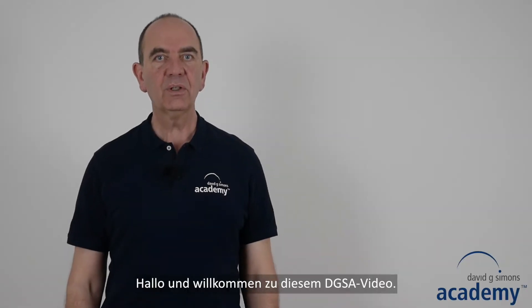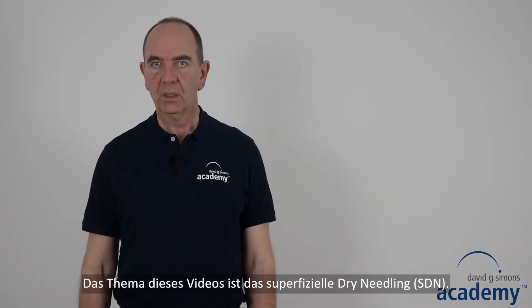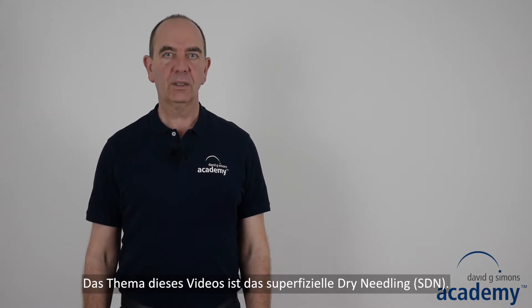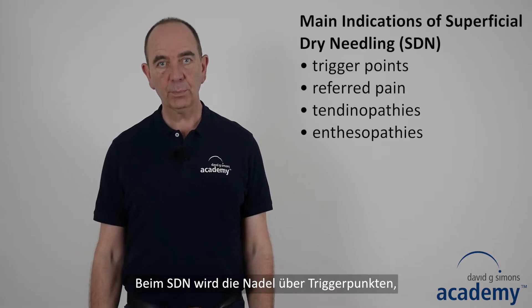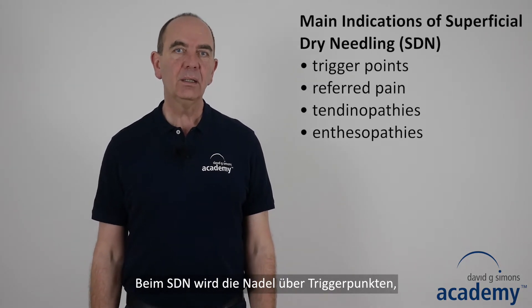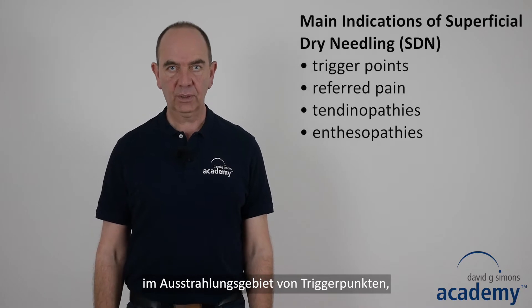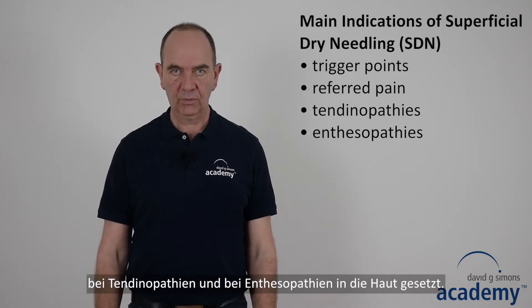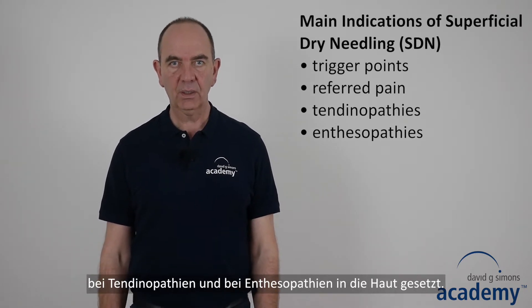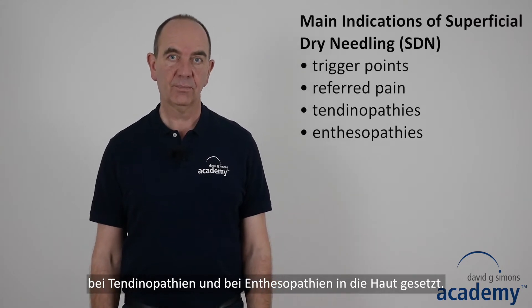Hello and welcome to this DGSA training video. The topic of this video is superficial dry needling. In superficial dry needling, the needle is inserted into the skin over trigger points, in the referred pain area of trigger points, tendinopathy and enthesopathy.